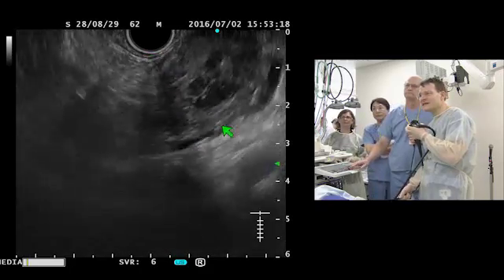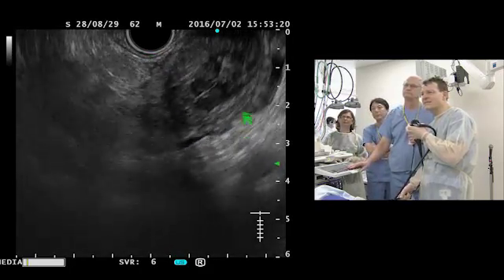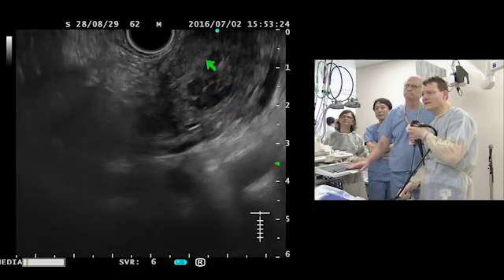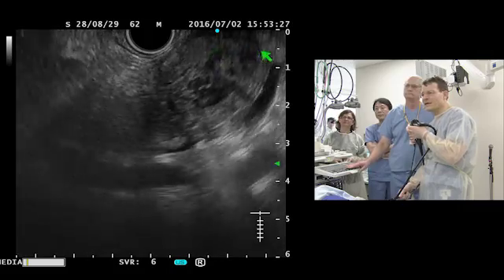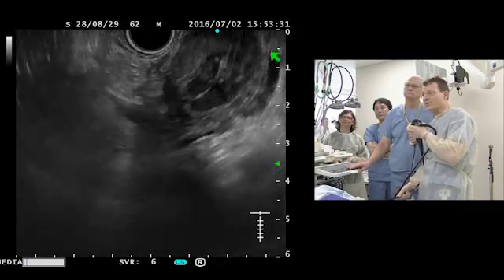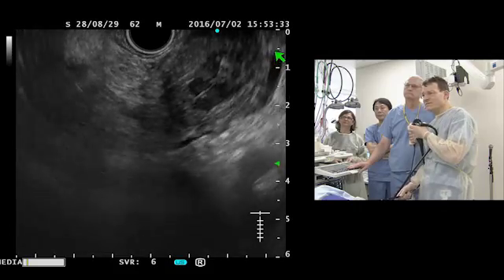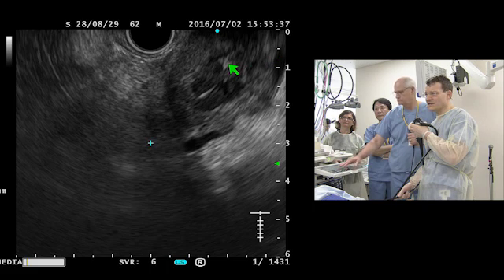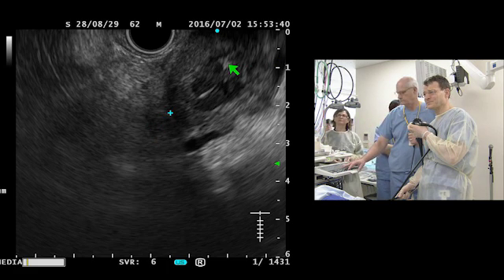Second point is that the lesion has some cystic components in the middle that we have seen already in the computer tomography. The third point is the lesion is relatively big. It is about the tumor. I think we can measure now. I expect about 4 centimeters.